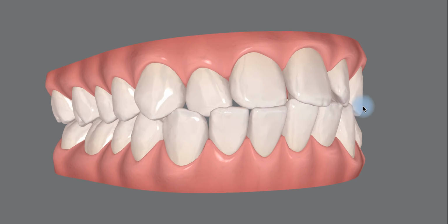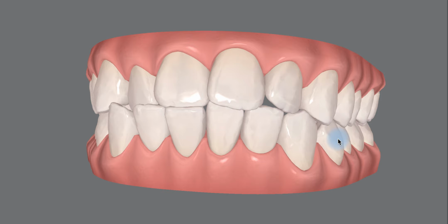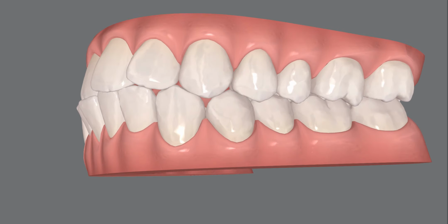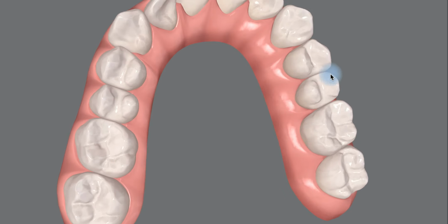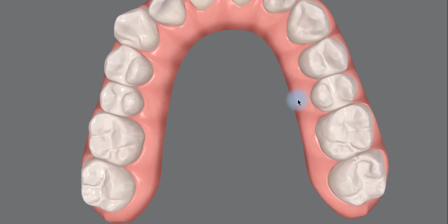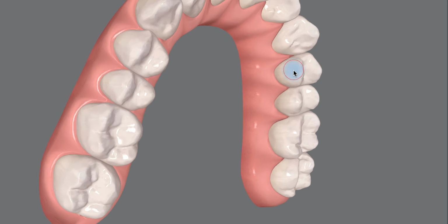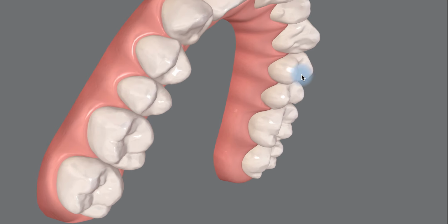Yeah, look at it from this angle. That flat surface there doesn't come from toothbrushing. It doesn't come from anything other than this tooth is interacting most likely with, I'm thinking the buccal cusp here. Let's take another look. I'm sorry, the palatal cusp. Yeah, so I'm not seeing a very significant wear facet here. There it is. Huh. All right. Well, we just answered the question.